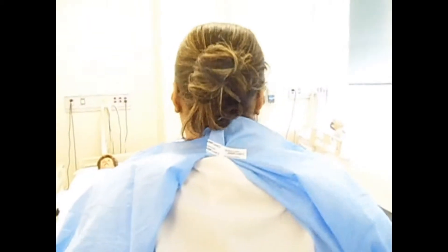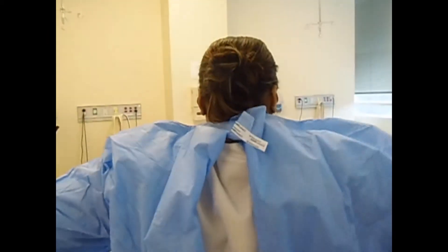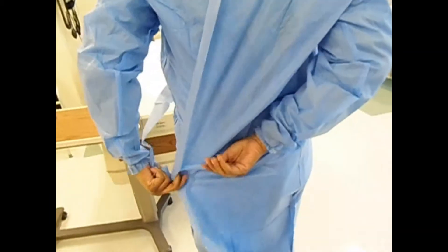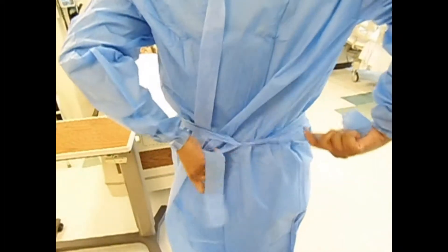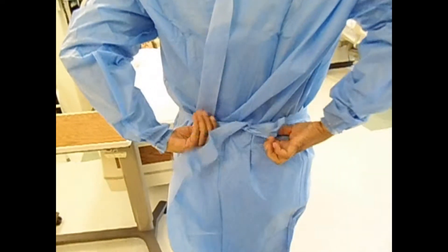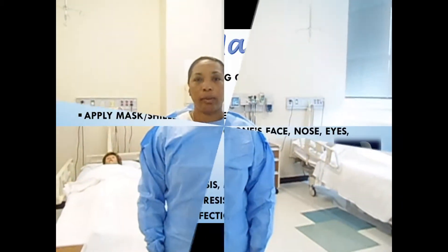Velcro this gown closed, then tie the gown — grabbing the ties and making sure the gown covers your clothing so no infectious material can touch it. Try not to tie the back too tight because you need to be able to get out of it. Putting on the gown is now complete.